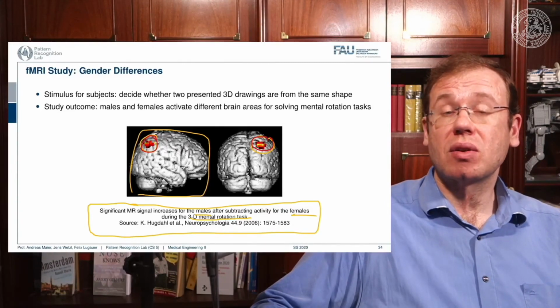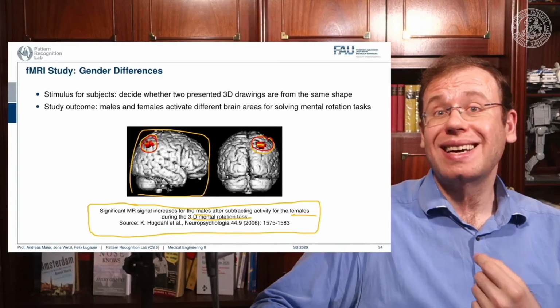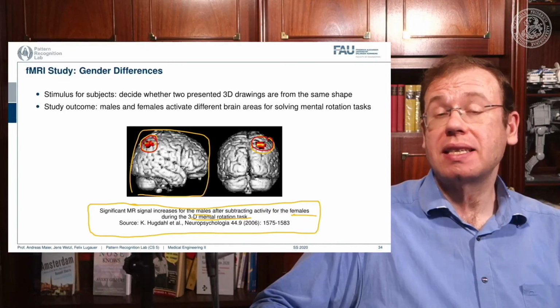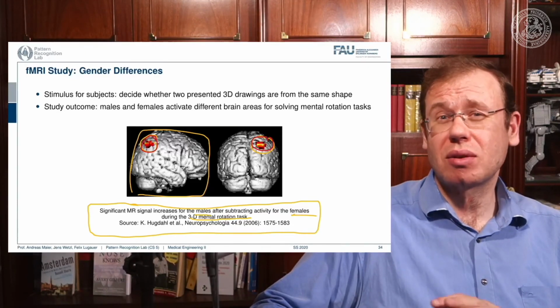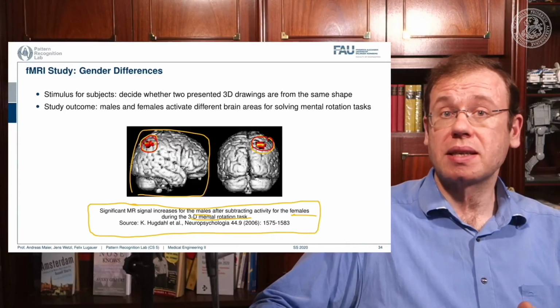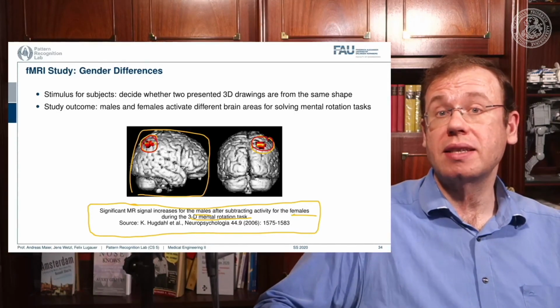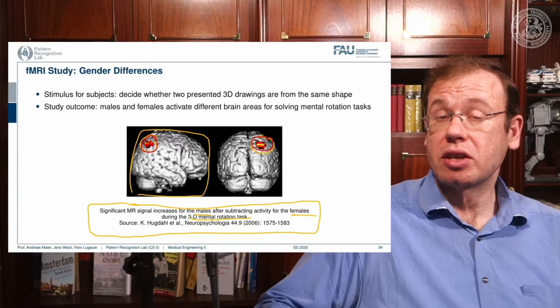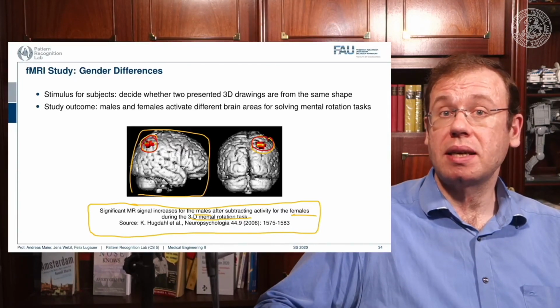There's more. There's also diffusion weighted imaging, and in diffusion weighted imaging you can essentially figure out the orientation of the Brownian motion inside a volume. This allows us to estimate fiber directions, for example in the brain, and this leads to the field of connectomics. Connectomics is used to reconstruct the connections between the different brain areas, and there are indications that in specific diseases the connection between the areas is changed, and therefore connectomics may be indicative of certain neurodegenerative diseases.